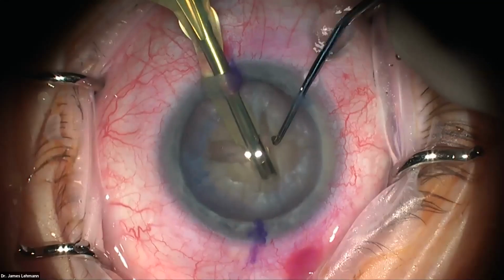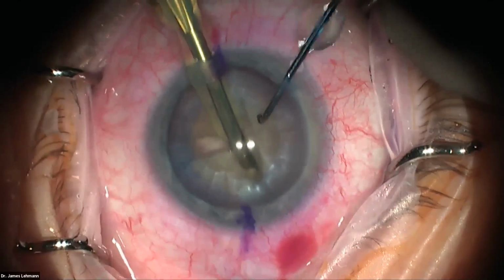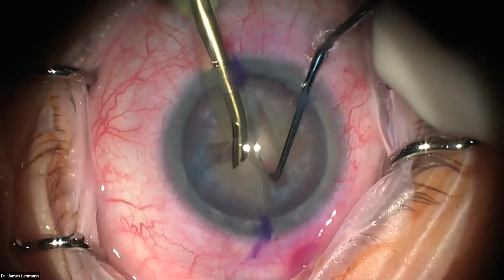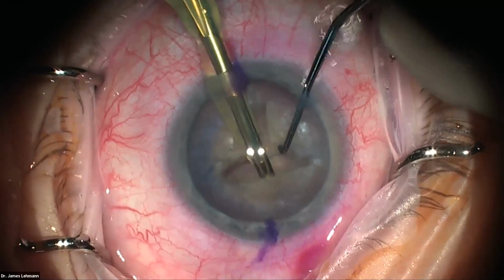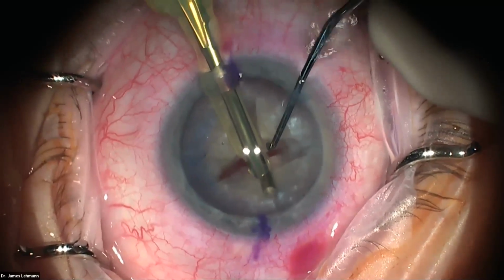And here's my groove from the first groove. So I'm just going back in that trench. And there I'm at the right depth. Cracks nicely, rotate my hand, spinning it around another 45 degrees, 90 degrees. And then I'm going to go on this last heminucleus.